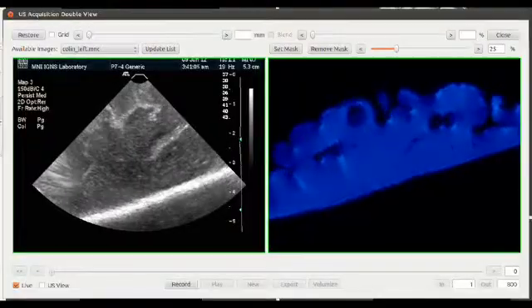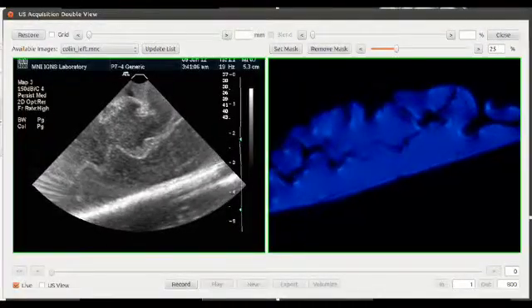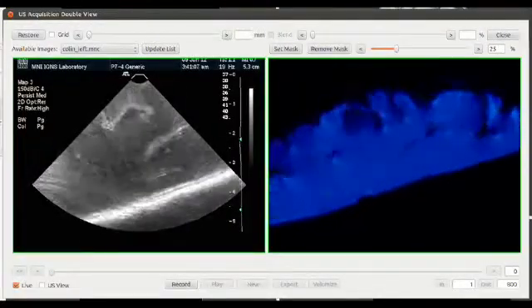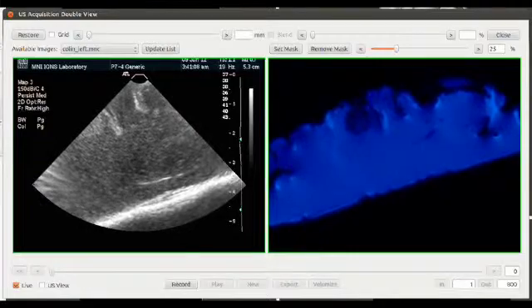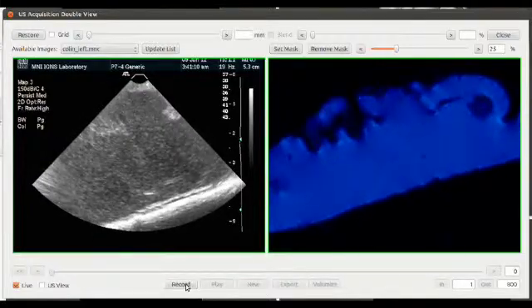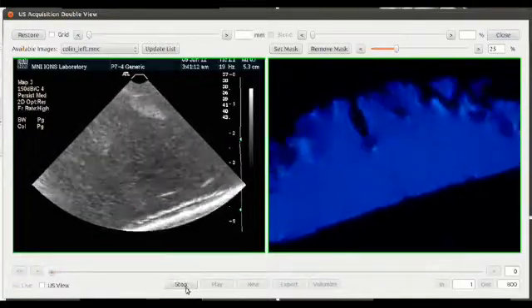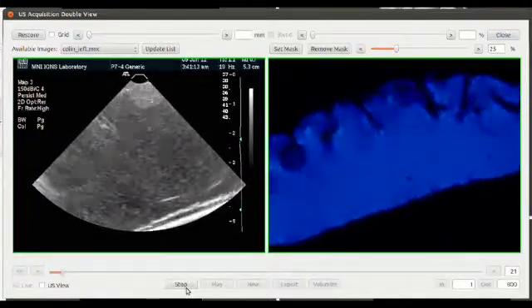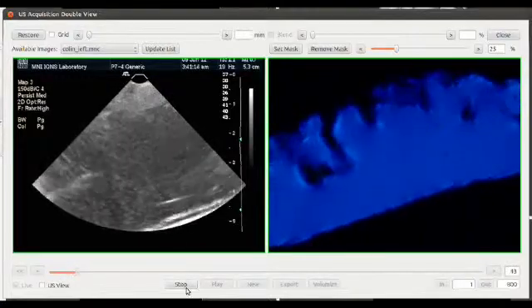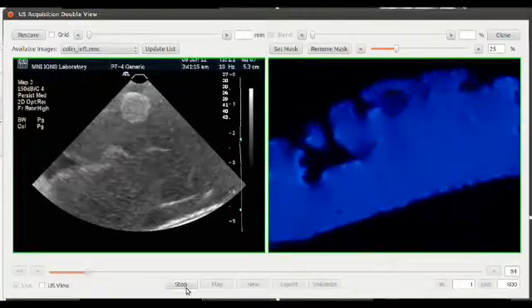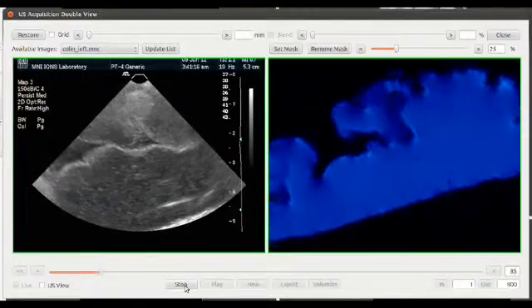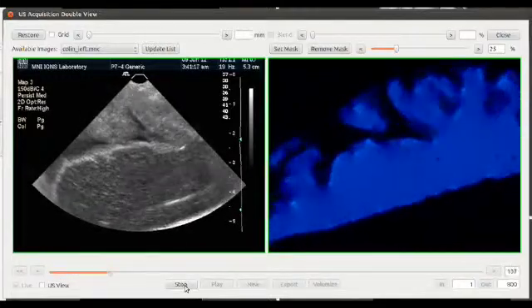When acquiring ultrasound images with IBIS, a double-view window allows you to simultaneously view your ultrasound slices, seen on the left, with the corresponding preoperative image slice, seen on the right.